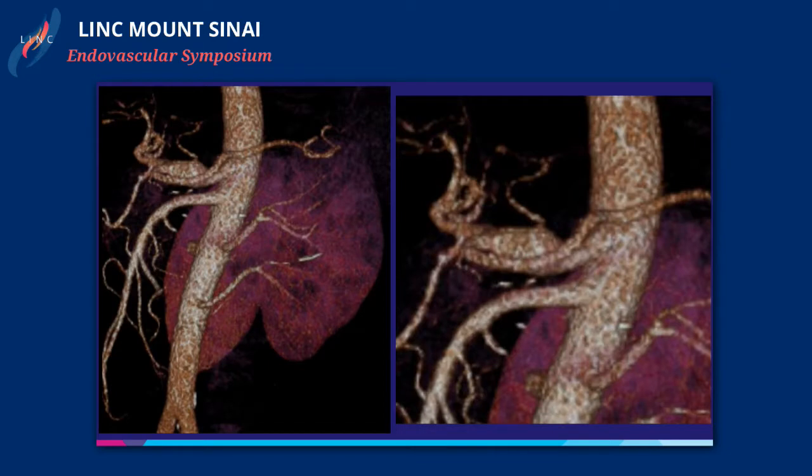And how about just embolizing? I land on celiacs all the time. Or embolize two of the branches and land a covered stent in the hepatic. Yeah. Definitely an option. The most interesting point to discuss is also, if we want to treat this patient, I wouldn't do that. But if we want to do it, which is the most important branch to preserve, the hepatic or the splenic artery? So we had a lot of discussion in our team. What do you think?